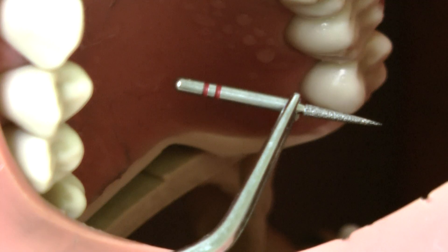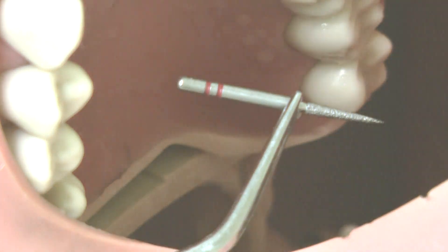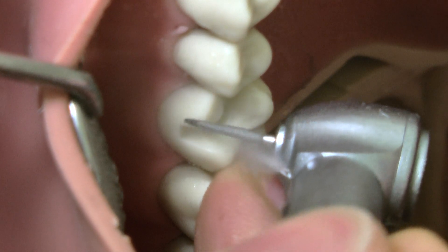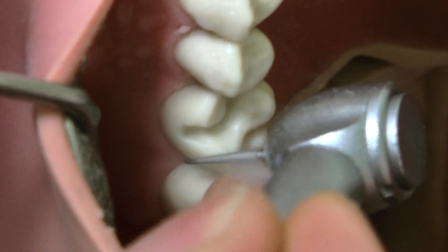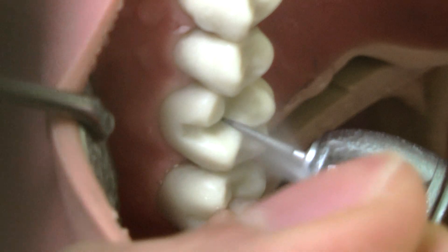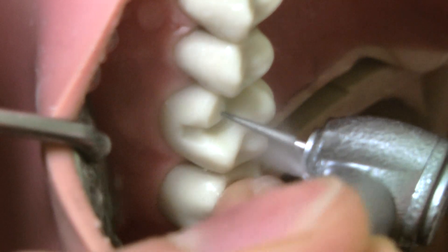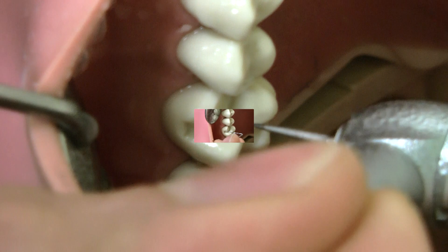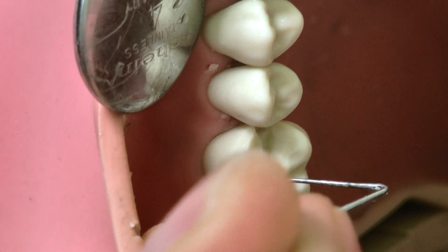The 260 bur is what we're going to use for the bevel, and for most of the polishing at the end as well. Hold the bur at 45 degrees and give it about 1mm bevel all around. Be careful not to cut the adjacent piece. The bevel should be literally all around, and even inside the cavity we do a gentle, quick bevel. There we go — the bevel is done, about 1mm all around the cavity.